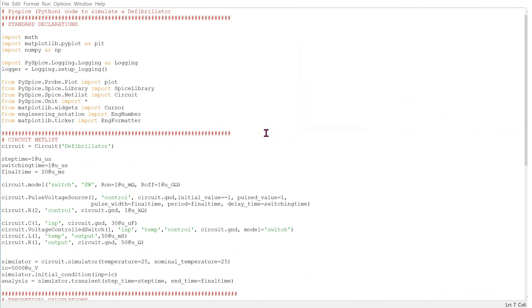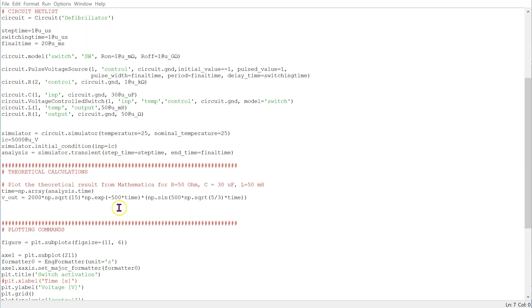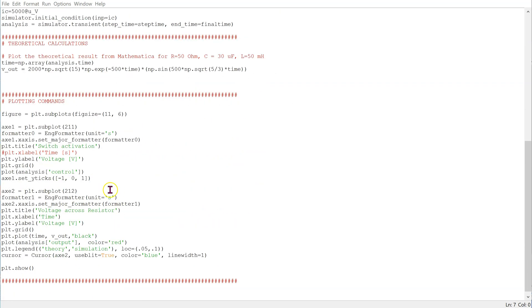This is the complete Python code to simulate the defibrillator circuit. The code is available in the comments section below. We have the standard spice declarations at the top, followed by the circuit netlist which we previously discussed, the theoretical calculations, and finally the plotting commands.